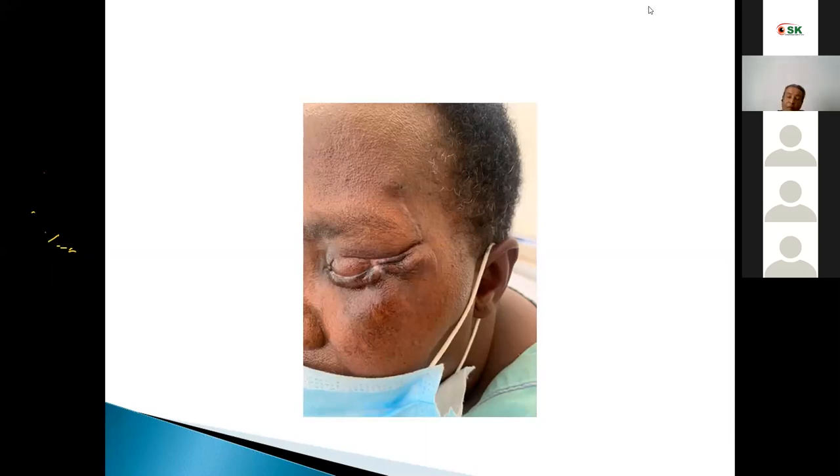Well, that's a very good question. Yes, there is a limit to how wide the flap can be, and the limit is because of the medial and the lateral canthus. You need to be slightly inside. It can be wider than you have seen in these pictures and what I've done, but you have to be slightly inside the medial and the lateral canthus. You don't want to squeeze a flap which is wider than the medial and the lateral canthus. So you can get a flap which is wide enough, but it has to be inside the medial and the lateral canthus region. The biggest problem, and this is where you have to be careful, is the bridge itself. The bridge has to be wide enough to capture the marginal vascular arcade. The vessels have to be there. Otherwise, you'll get a bridge necrosis, and the outcome will not be good at all.